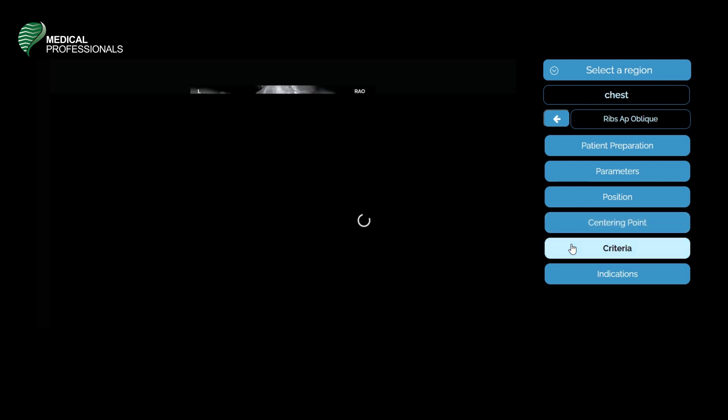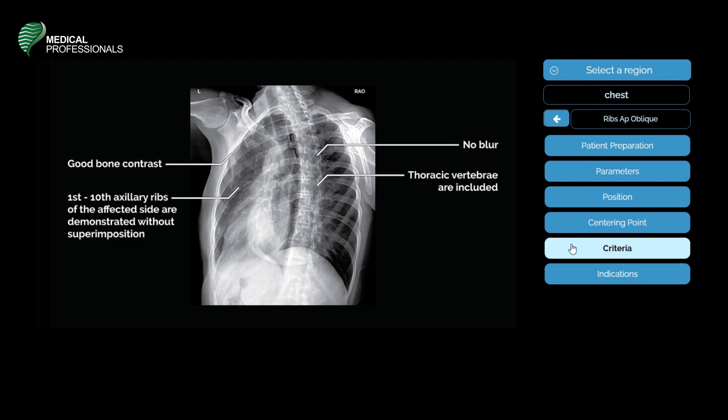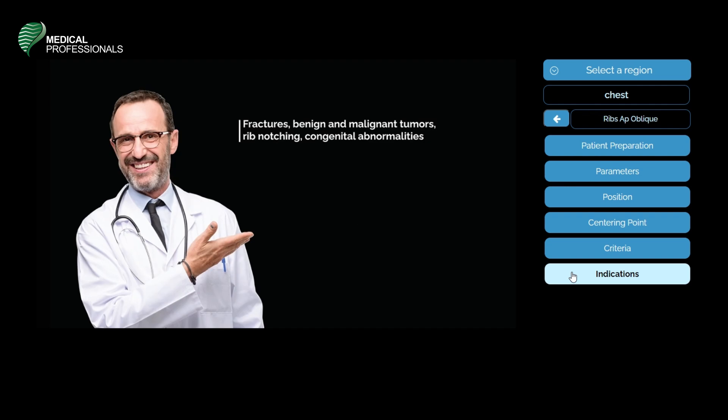The evaluation criteria for the oblique AP of the ribs: there should be good bone contrast and no blurring. The first rib through the tenth axillary rib of the affected side should be demonstrated without superimposition, and the thoracic vertebrae should be included. Indications include fractures, benign and malignant tumors, rib notching, and congenital abnormalities.